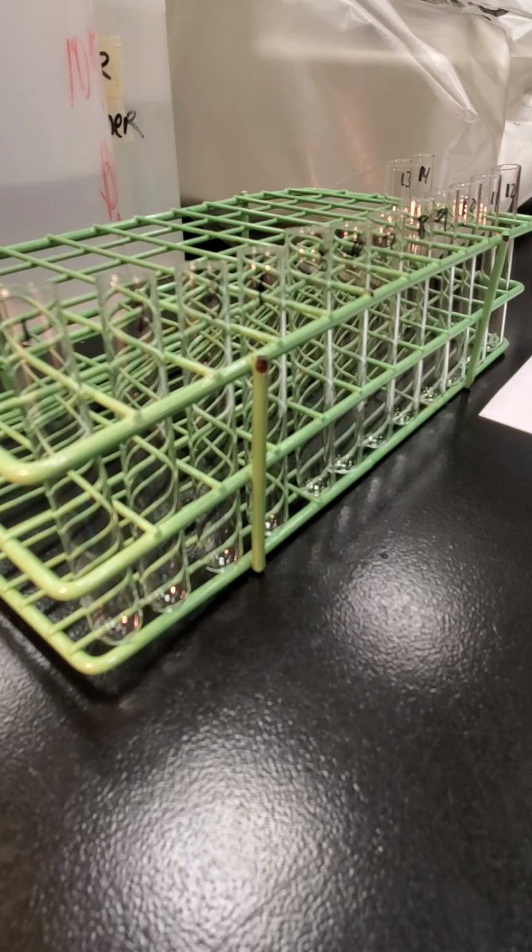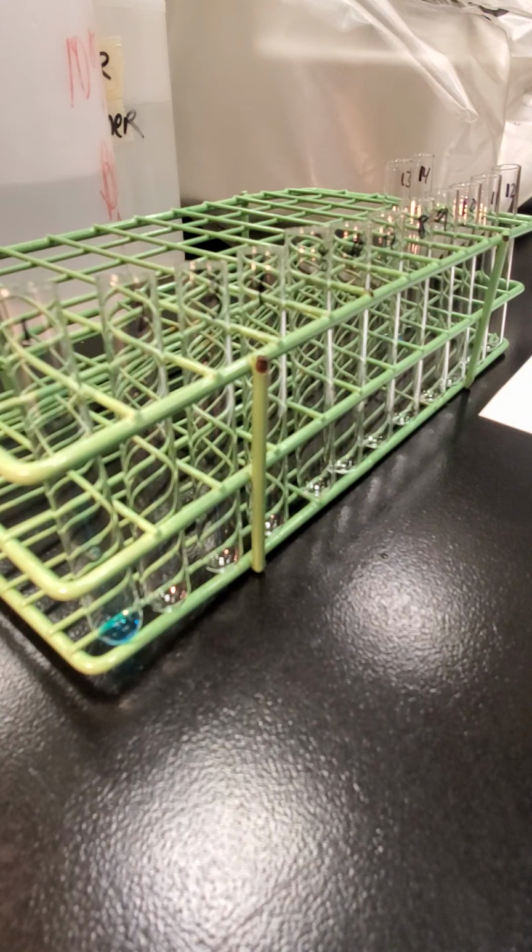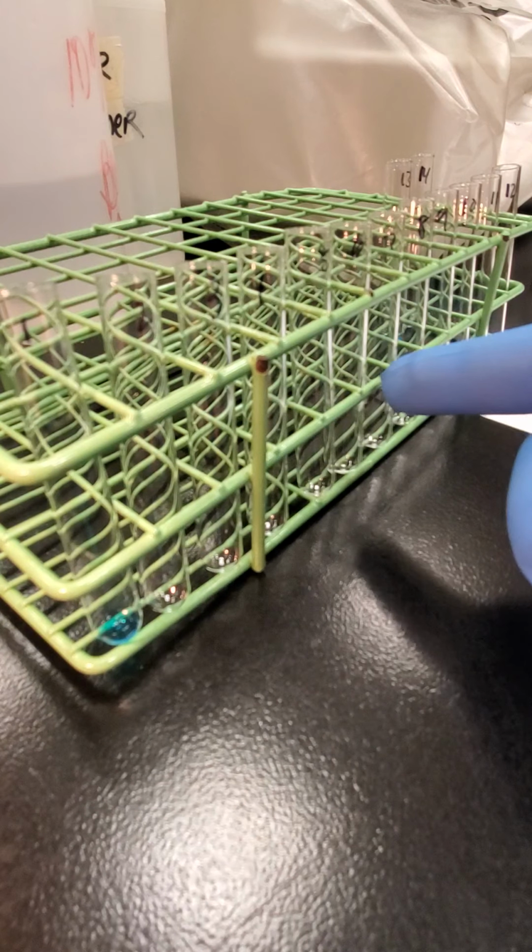Okay. So I'm just going to follow the procedure that I've uploaded. We're going to use 14 tubes, which I've labeled already. And I'm going to start dispensing our reagent. So I'm going to add anti-A reagent. These couple tubes are going to test the ABO testing. So anti-A to tube 1 and then to tube 13. So these first 6 tubes are going to be for ABO.